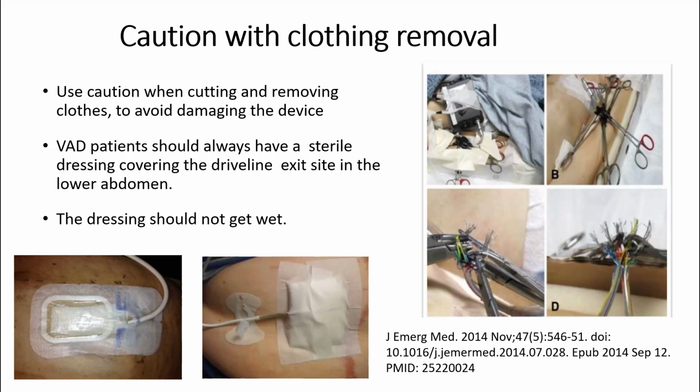But he had an adult diaper on, cutting it off, and he cut his own drive line. And as soon as he cut it, because the pump inside the patient's chest was not getting information or power from the controller outside the patient's chest, the patient's perfusion dropped. He was found unconscious, unresponsive. He was in arrest. They listened to his chest. There was no little whirly whirl sound. So they actually transported him with CPR in progress.